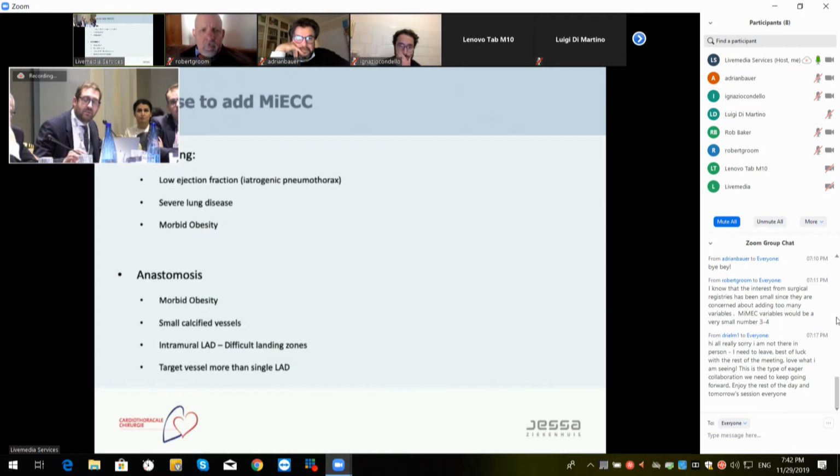But why do we now do this with off-pump, and why do I mention it? The purpose of adding MiECC is that, after my abstract presentation at the ISMICS in New York, Sam Bauke and Mark Uel were discussing with the floor: if you have patients with severe lung disease where single lung ventilation is not possible, or morbid obesity, what would you do then? Would you still do MICS?